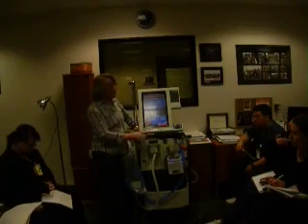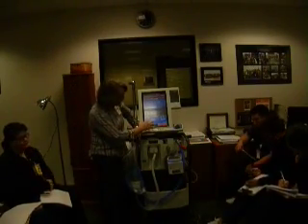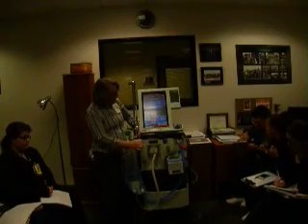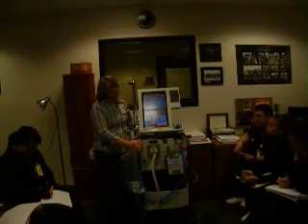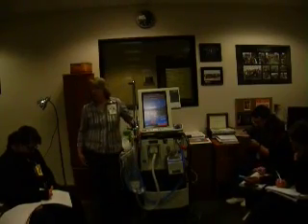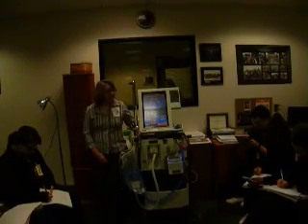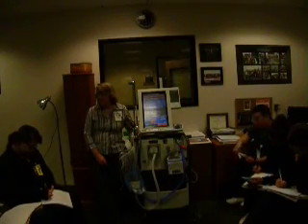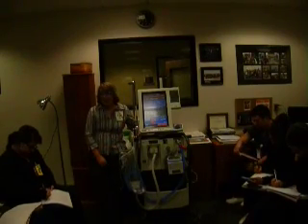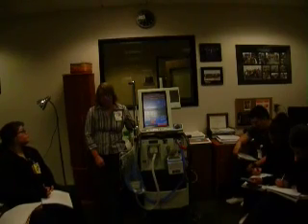Right. So we do the mode, and remember, there's two parts to every mode. We have to have the AC or SIMV, but then we have to have the volume or pressure component of it. Remember, it's not just one or the other; they go together. So we'll set that. Then, under mandatory type, you can do PC, pressure control, VC, which is volume control, and VC plus, which is this vent's version of PRVC. PRVC, remember, is pressure regulated volume control. It's the one where we can set pressure and volume. So you're always going to have two parts here. We have to pick AC or SIMV, and then pressure or volume or both. Everybody okay so far? Yep.